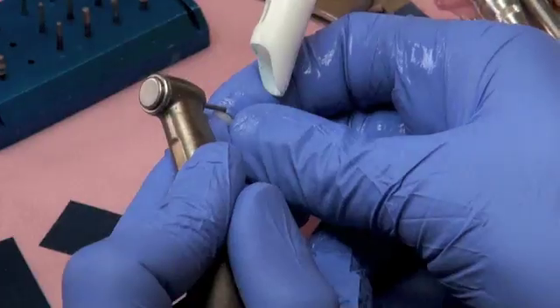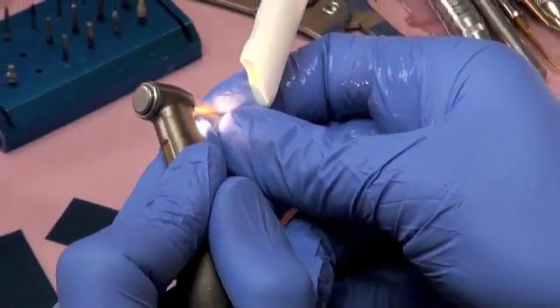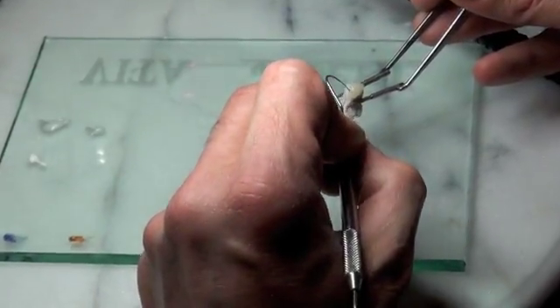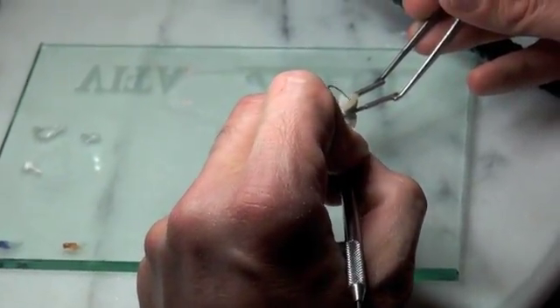Within seven minutes the veneer is carved out and ready to try in. Some brief final adjustments to the veneer are manually performed outside of the mouth, and the porcelain veneer is customized using stains and glazes to ensure a perfect match to her surrounding teeth.